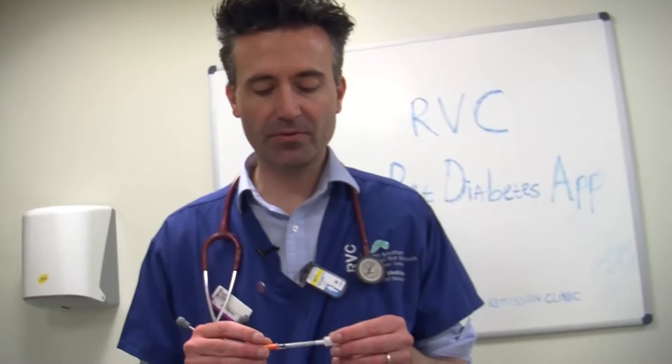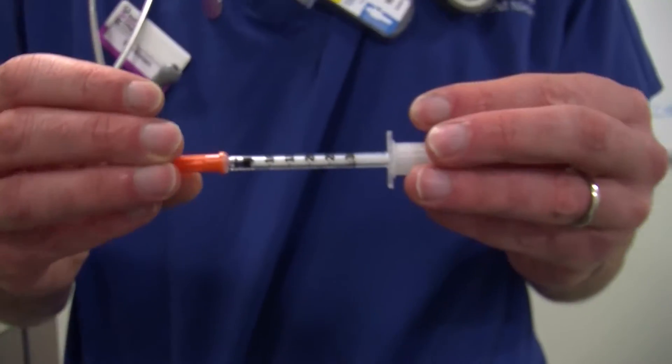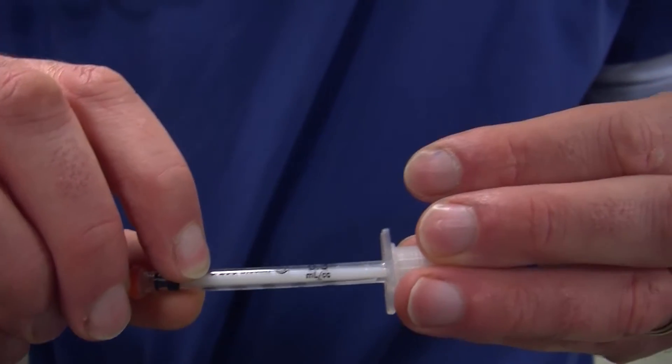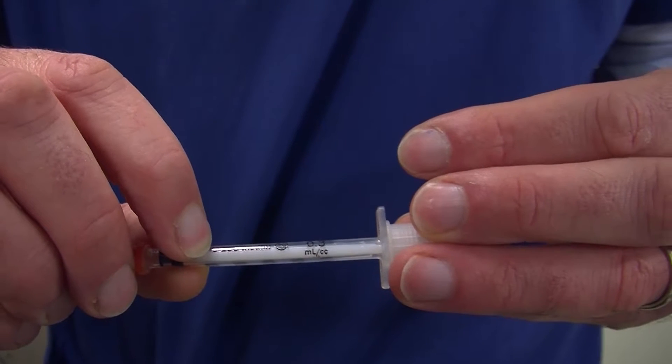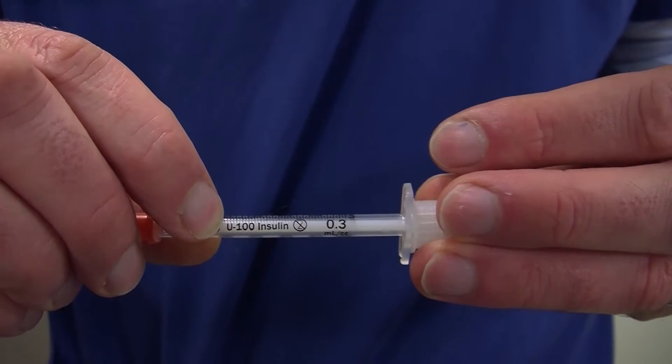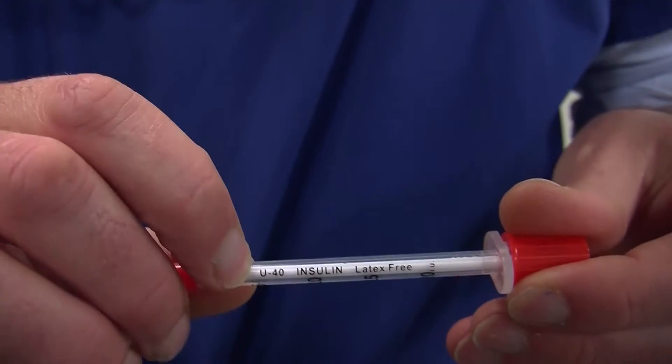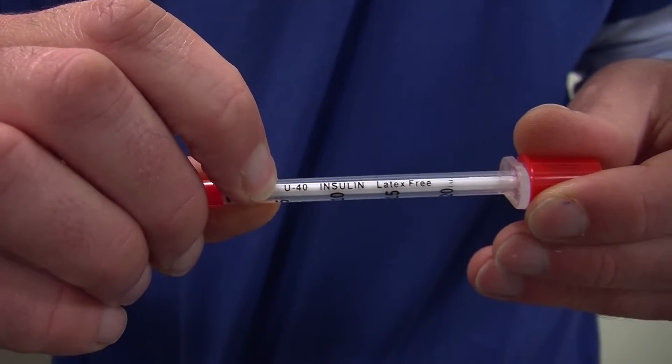When we use syringes, we need to be absolutely sure that we use the right type of insulin syringe. The essential bit to look out for is the U40 or U100 differentiation. How to recognize that? I've got a syringe here, and we're looking for the U number. The U stands for units — 100 stands for 100 units in a milliliter, so U100. Whereas other syringes have, for instance, a U40, so 40 units per milliliter.